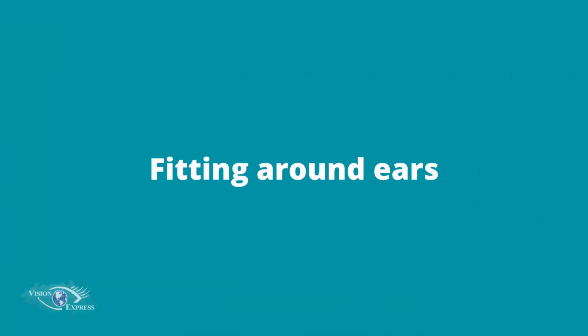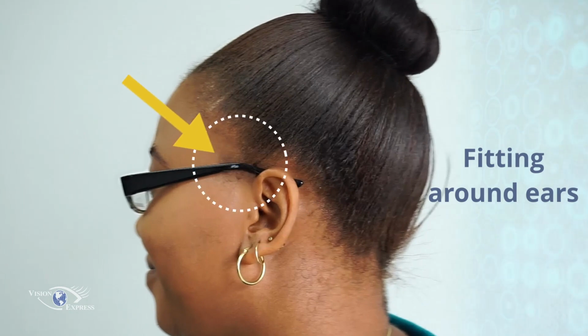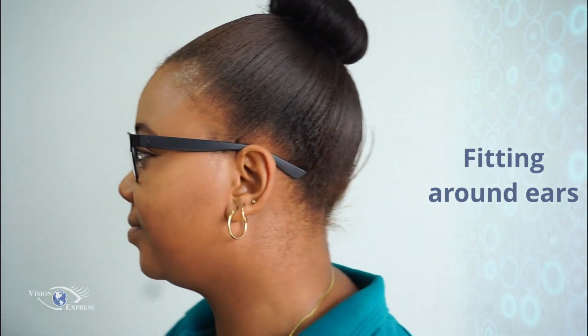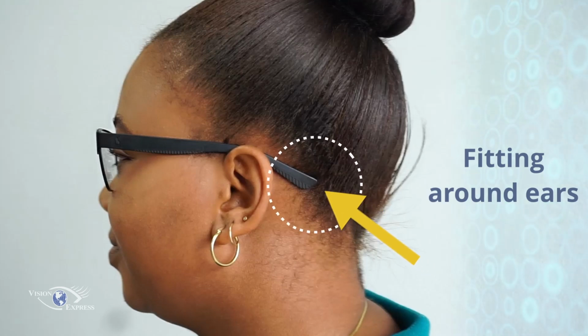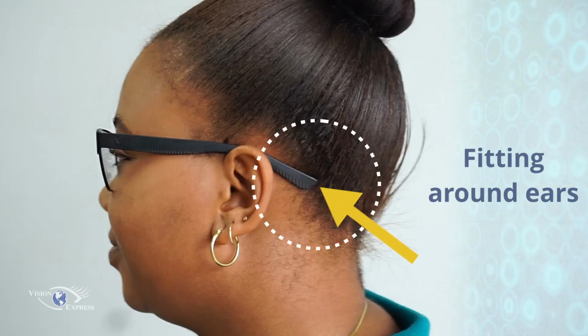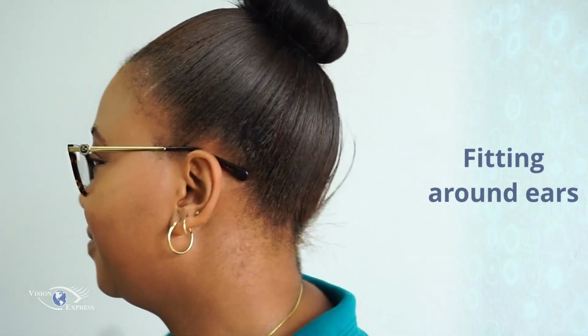Fitting around the ears. The curve of the temple should not be in front of the ears. In this situation, the handles are too short. Also, if the handles are too long, they can get stuck in the patient's hair. This can cause pressure on the hinges of the frame, which can cause premature damage. The ideal fit is that the curve of the temples should sit right over the ears.